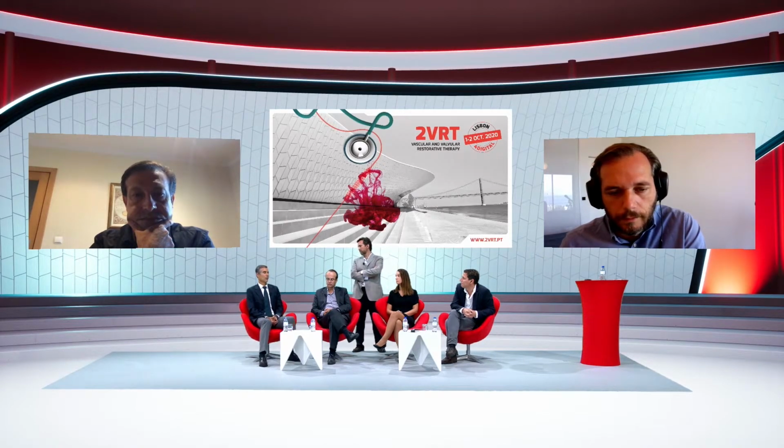I think it's a good option to have also in the cath lab, although personally in most of the cases that I do, I still use the planning with cardiac CT, and then I perform the angiography and use the reference on angiography to do the puncture. With good planning with CT and with angiography, you can also do the case.